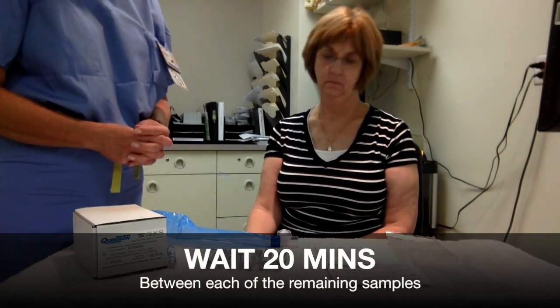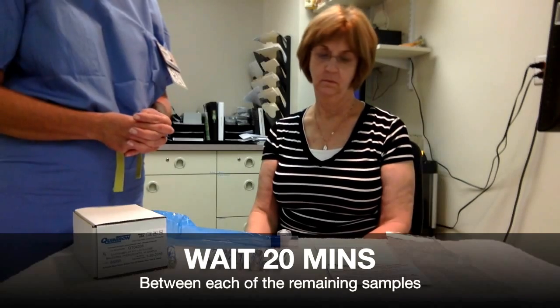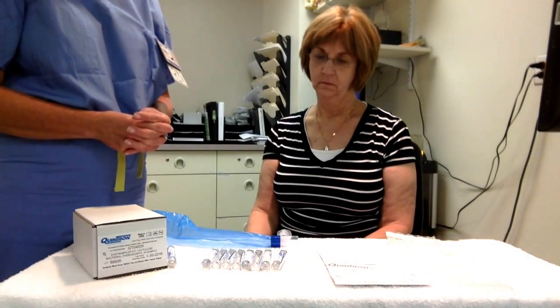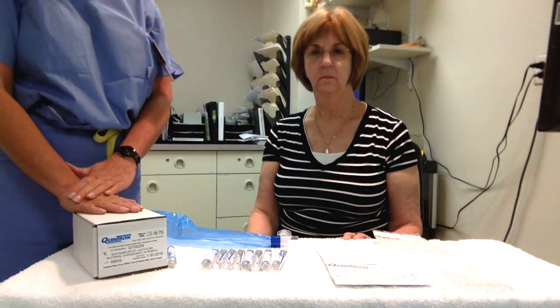Repeat the sampling every 20 minutes until all the tubes are used and the test is completed. Once you are finished, place the tubes in the bubble wrap, place the bubble wrap in the box and return to the hospital.